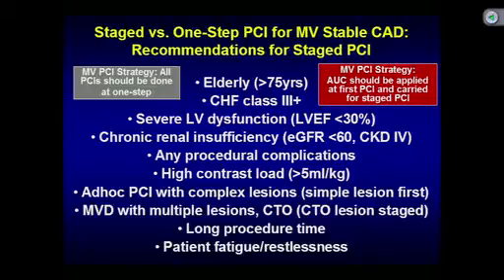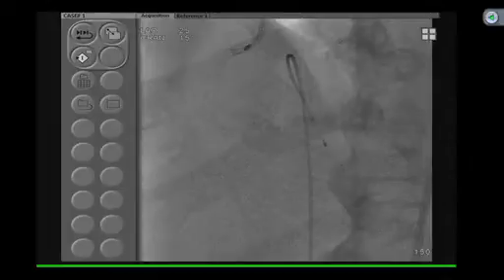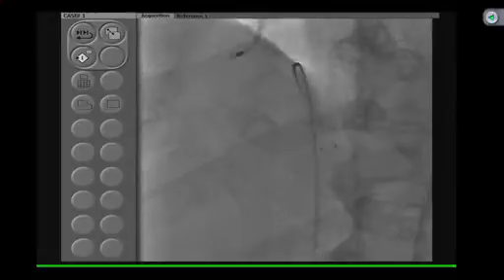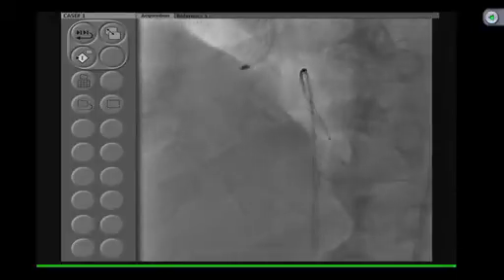With that note, Annu is ready here to do the intervention, and we can come back to the angiogram. The Burr is actually in the guide. I think the technical challenge in this particular case is that we have selected the 1.75 Burr, as we had decided. Now as you are coming out of the guide, you see here the vessel has a nice takeoff of the RCA. The problem would be if you have an upward or anterior takeoff of the RCA; this is where you will face a problem getting the Burr into the vessel.